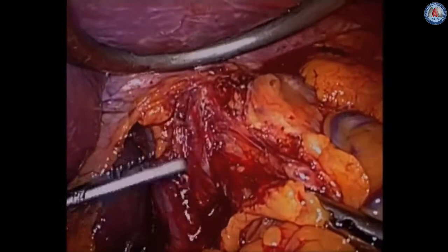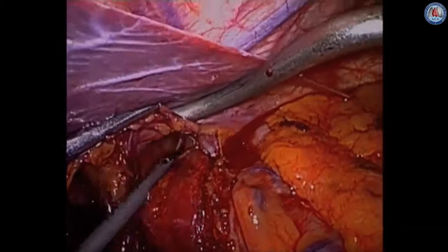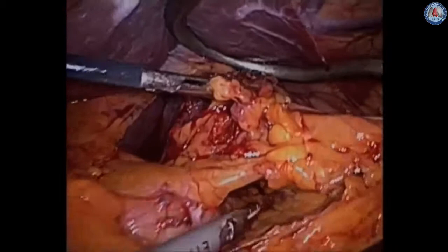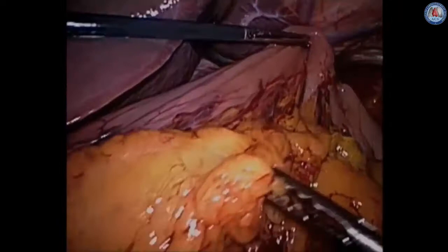There may be an occasional replaced left hepatic artery which needs to be divided. We further dissect up into the hiatus and get some distal esophageal mobility. We make sure we have circumferential mobility around the distal esophagus and then begin to expose the left gastric artery, taking down all the omental attachments so that this area is fairly isolated.